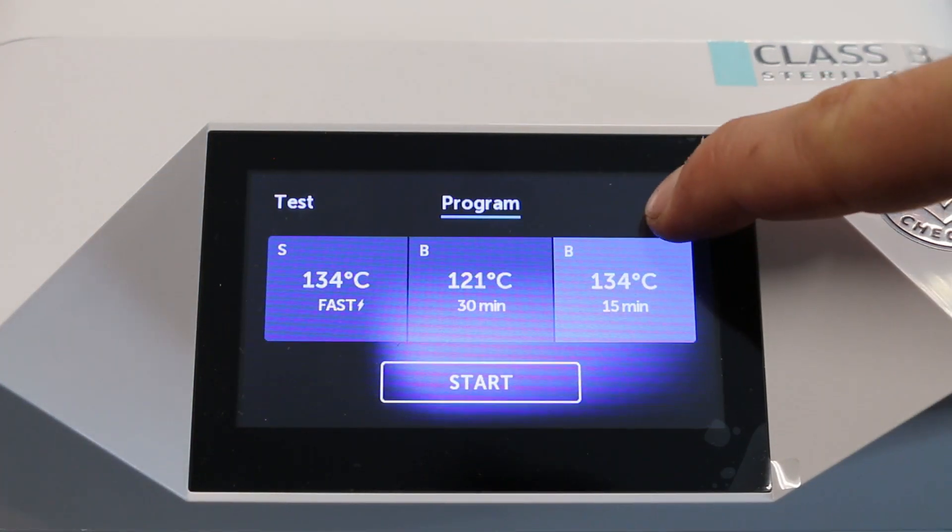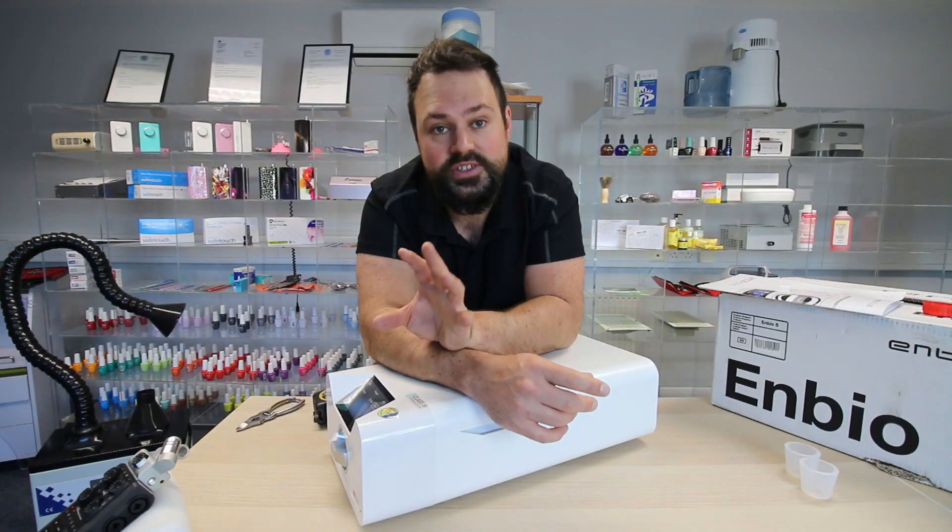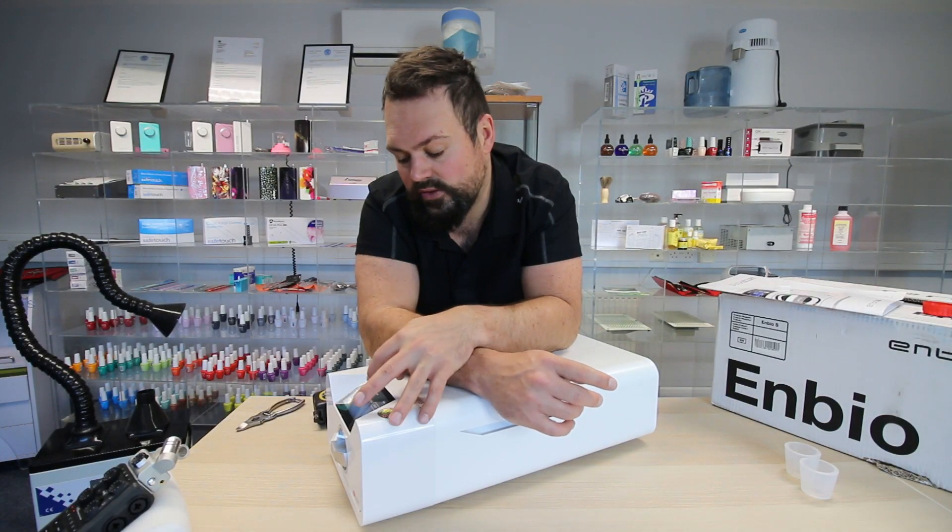There's also an info tab. Your info tab is where your serial number is — very useful, as you'd otherwise have to lift the unit to look underneath. It's got the date and time, how many cycles you've run, how many cycles until your next service. You can change the language and also adjust the noises. There's not a lot going on for you to get wrong, and this is what I love about the design and software on this.